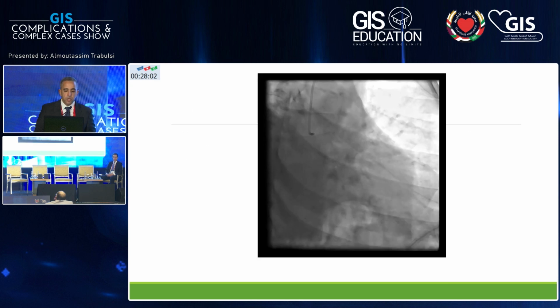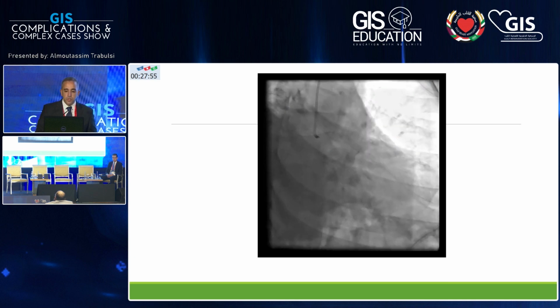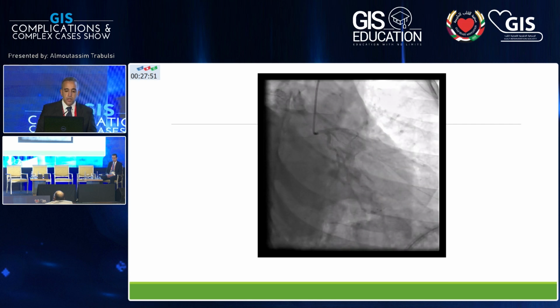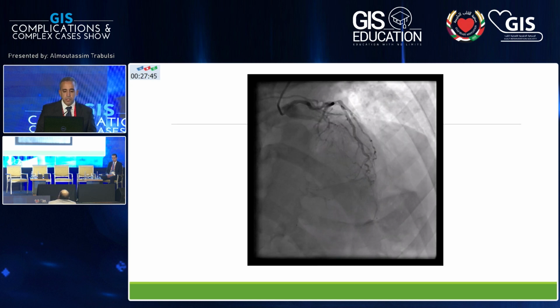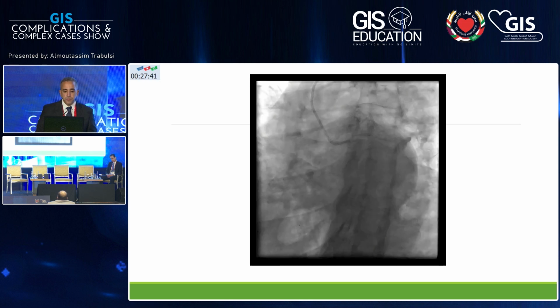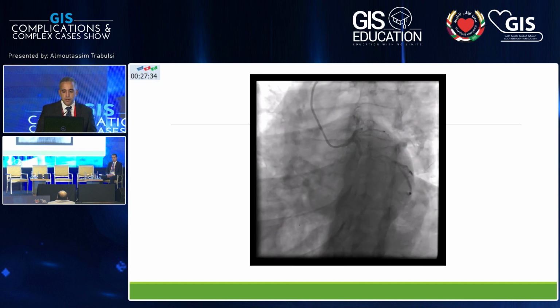underwent coronary angiography. This coronary angiography was done back in May in the outside facility. As you see, there's an occlusion in the LAD diagonal, and also severe stenosis in the left circumflex coronary artery. His cranial picture also shows occlusion in the LAD diagonal. These are also more pictures showing how extensive disease he had.